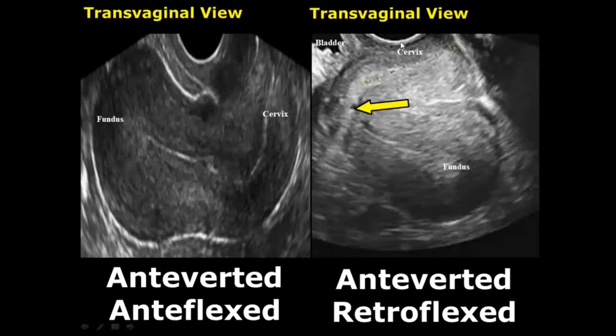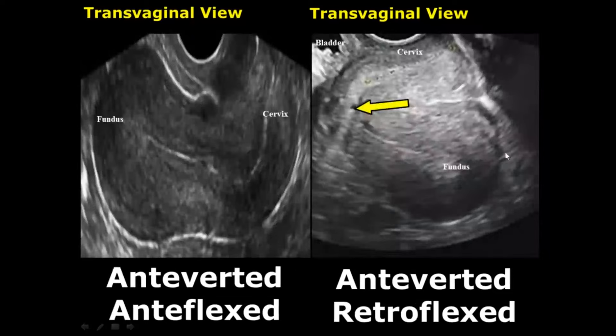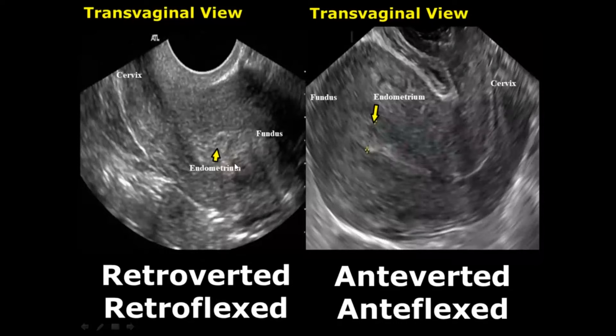Here we have the anteverted and retroflexed uterus. The cervix is again facing anteriorly, upward. The body of the uterus is bending away from the bladder, posteriorly. The bladder is in the top left corner of the image and the uterus is bending away. Another feature is that in retroflexed uterus, the fundus or body will appear on the right side of the image.